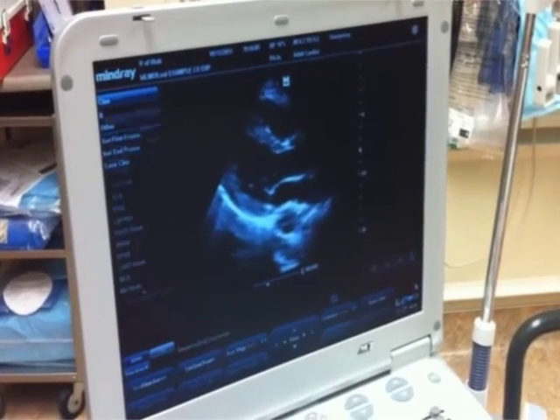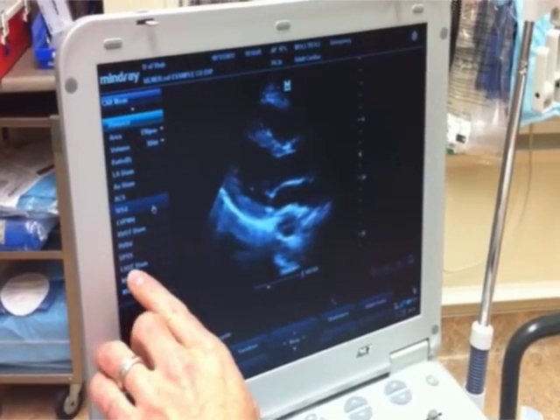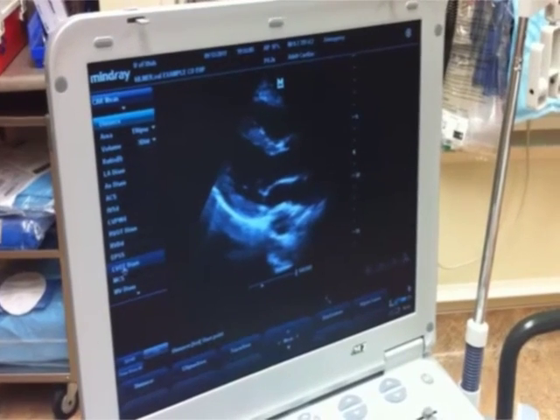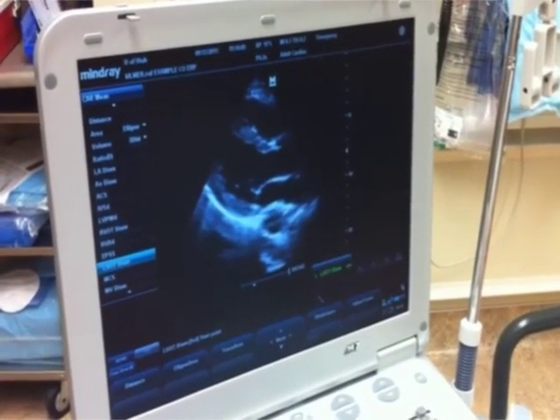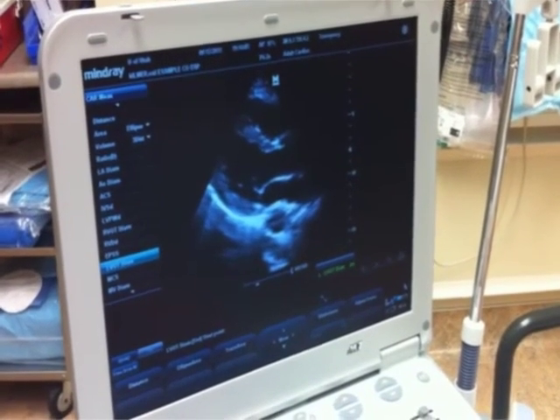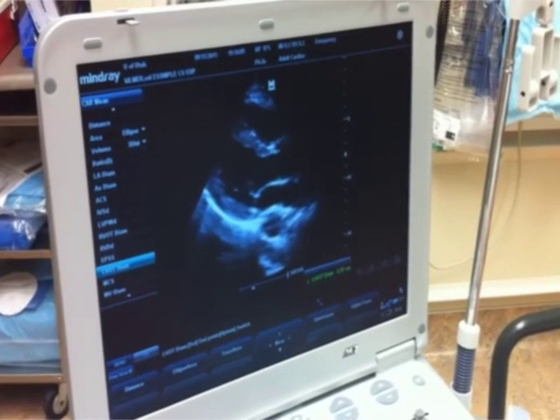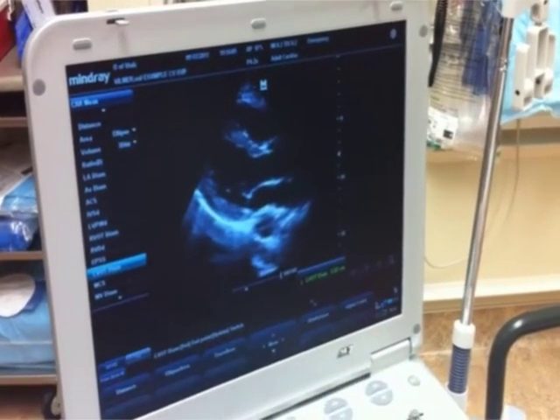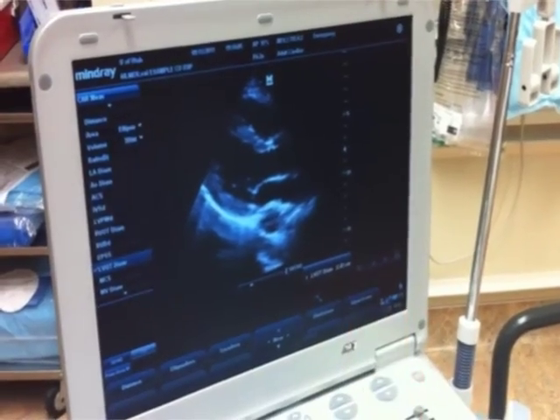Now I'm going to hit the measure button, and after I hit the measure button, I'm going to go over and choose left ventricular outflow tract diameter. Now remember, this is to measure the cardiac output, so I need to know the area of the LVOT, and that's measured by getting the diameter. Here I'm going to measure that diameter in systole, and I found that diameter to be 2.3 centimeters. So that's our LVOT diameter, and that's all I need in this view.